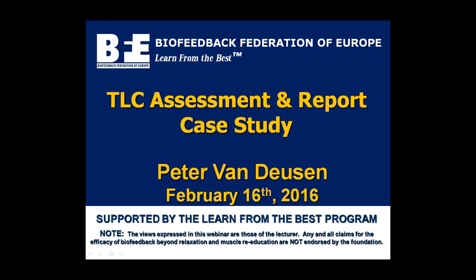Hello everyone, welcome to today's case study presentation based on the use of the Learning Curve Suite, also known as the TLC Suite. Today's session will focus primarily on a client evaluation with the TLC assessment and analysis using the TLC report, which generates a whole brain training plan.